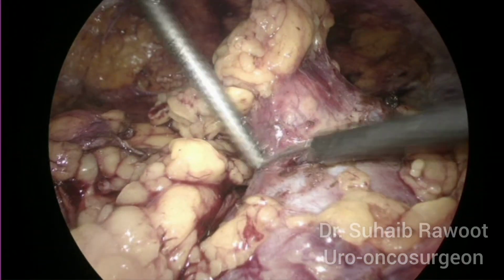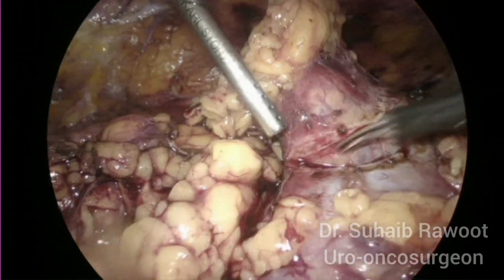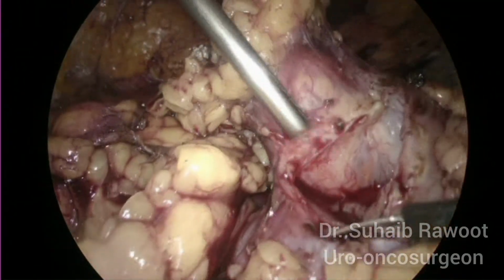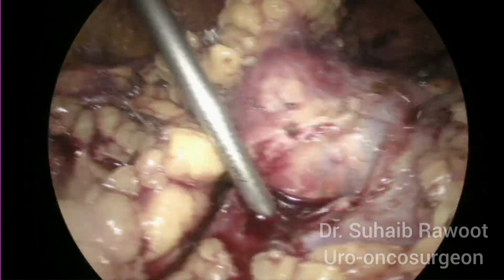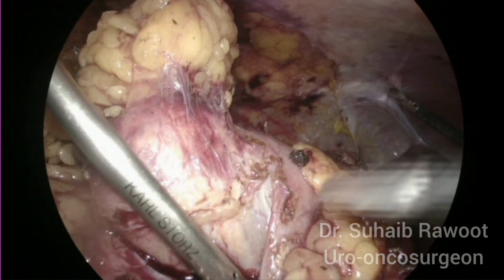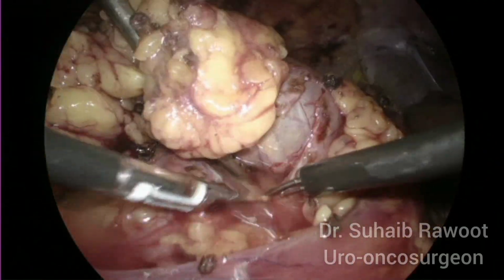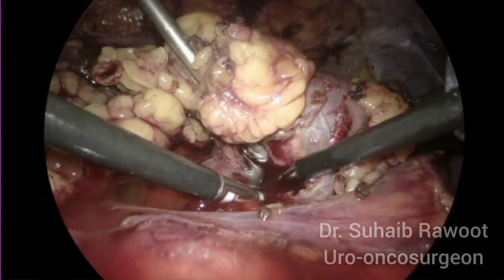Now we have opened the renal capsule, and as we go inside, the tumor margins will be visible. The role of the assistant is very important here. You need a really good assistant. He needs to suck, irrigate, as well as retract at the same time. As you can see now, the tumor boundary is a little bit visible.